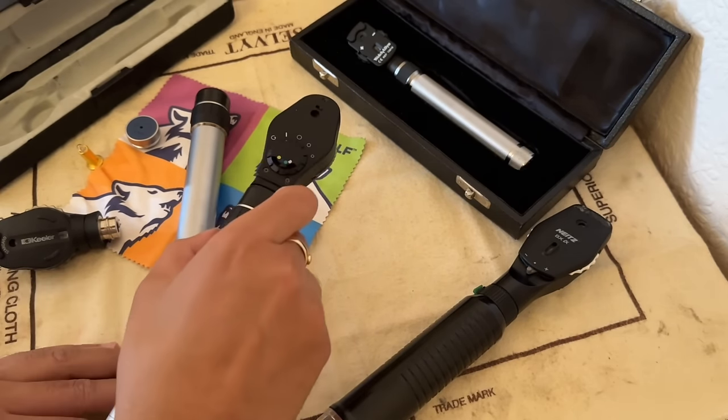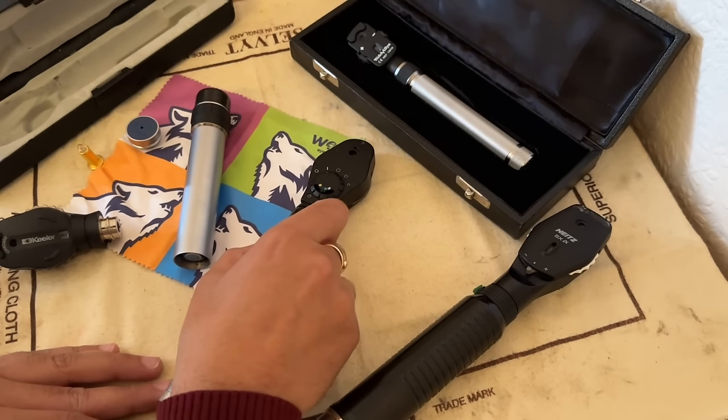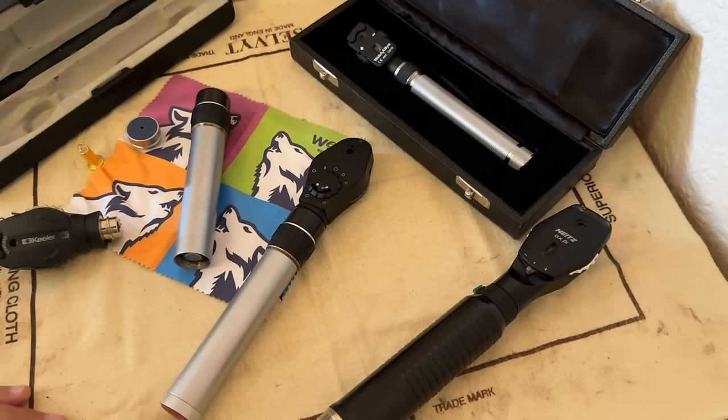So that's a brief look at the ophthalmoscope. Let's perform some ophthalmoscopy on some patients. I'm going to be doing a test that looks at the health of the eye, using the light of the ophthalmoscope to check the external eye and then internally. There might come a point when I just have to move the lids, but I will let you know when that happens.